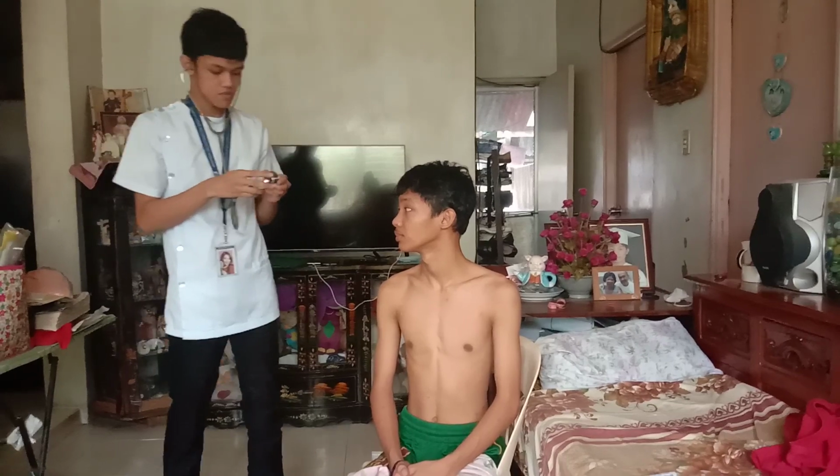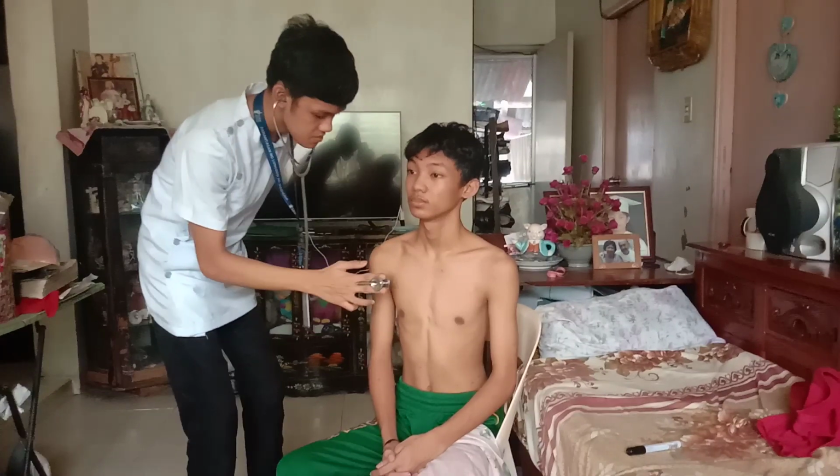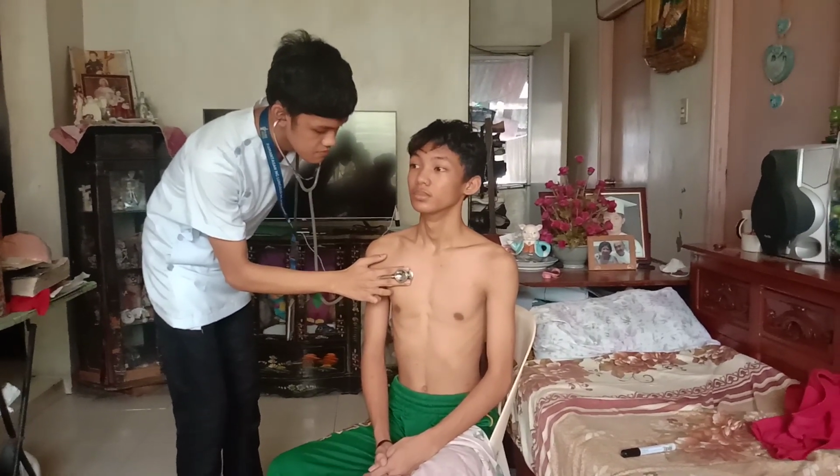So in auscultation, use the diaphragm of the stethoscope. And now, again, compare the left side of the chest and the right side of the chest. Inhale, exhale.